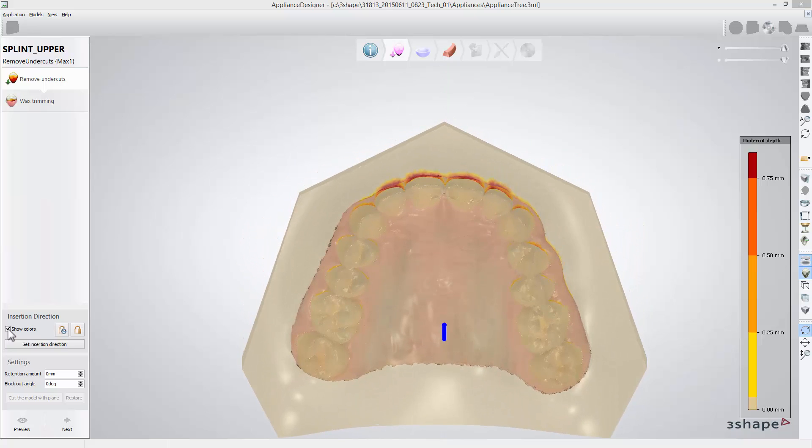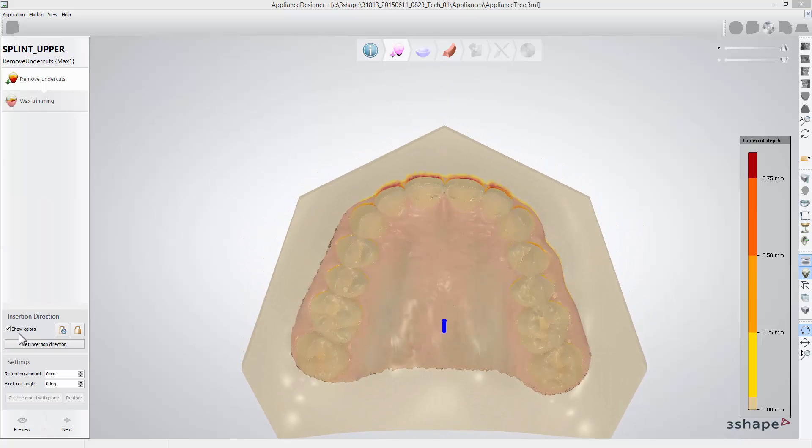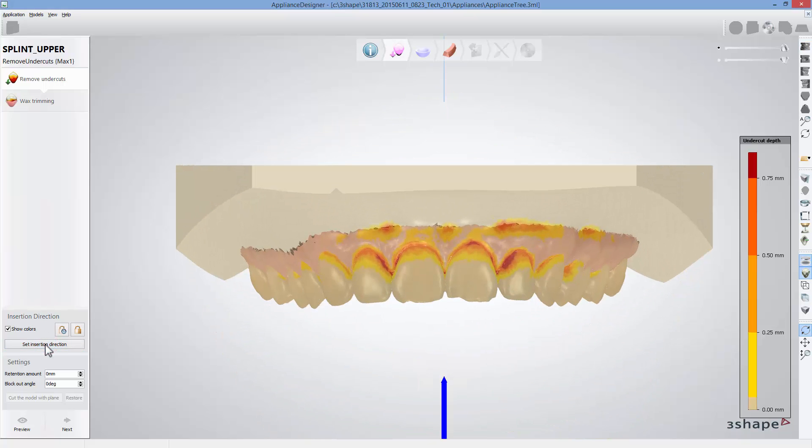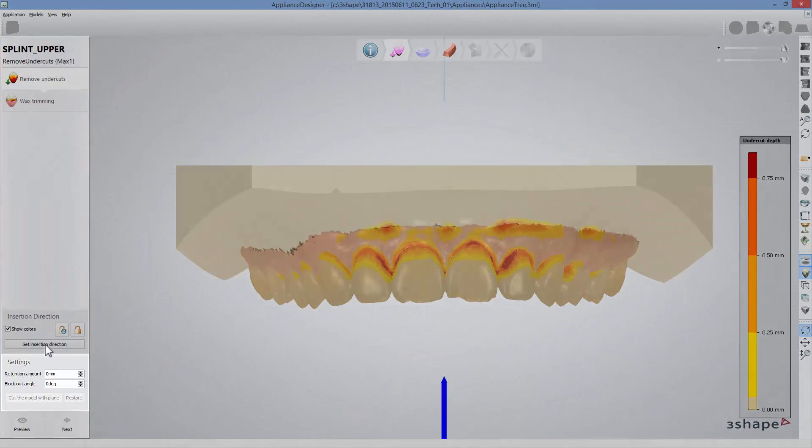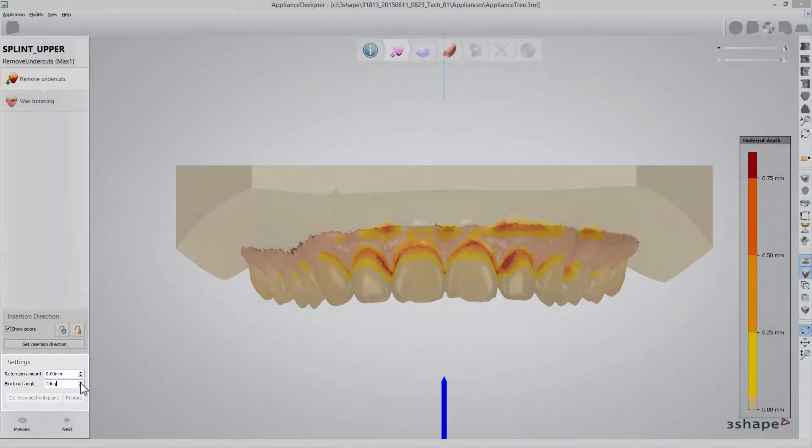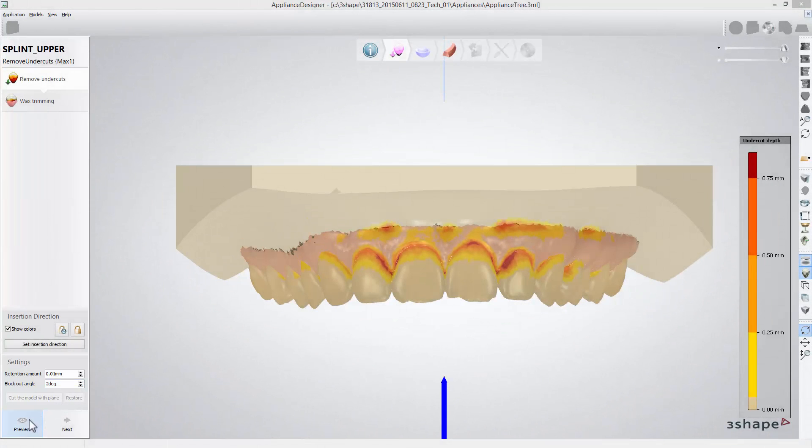Just adjust the model's position and click the set insertion direction button. Having insertion set, in the settings menu you can specify the amount of retention that will be left in undercuts after blocking out and you can set the angulation for the blocking out material in the block out angle box.